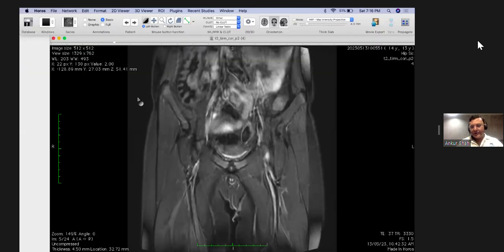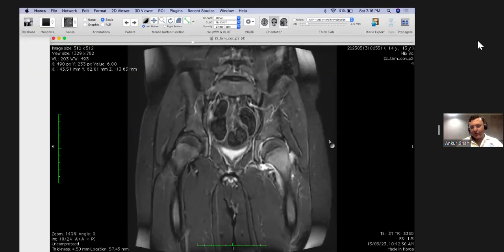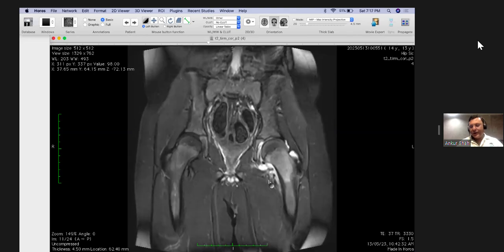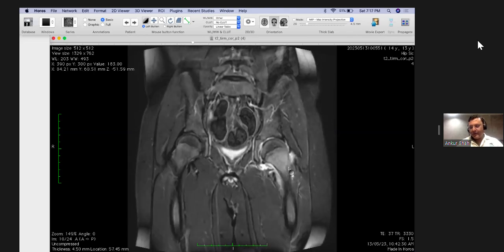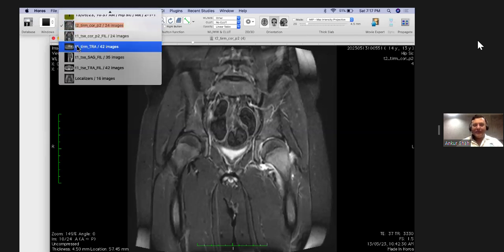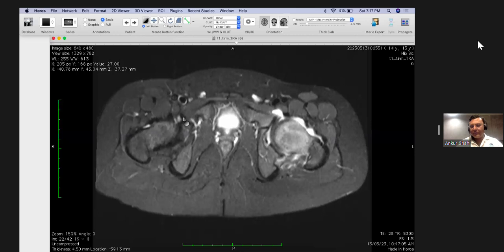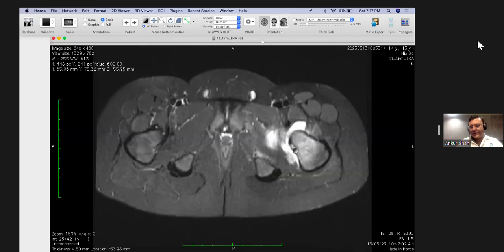Like here, this young boy, 13 years, we saw it in the MR. There is an edema, there is effusion, but if you look at the pattern of edema, it is not fitting into the classical stress injury spectrum. And whenever you see this, look carefully for those bones, to look for subtle areas. And if you can see here, there is a small focus of hyperintensity here.